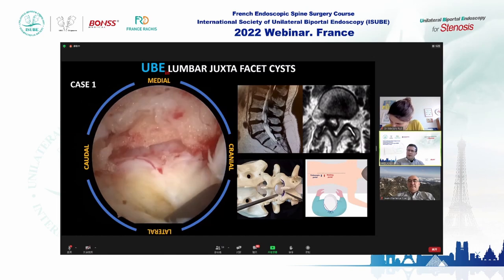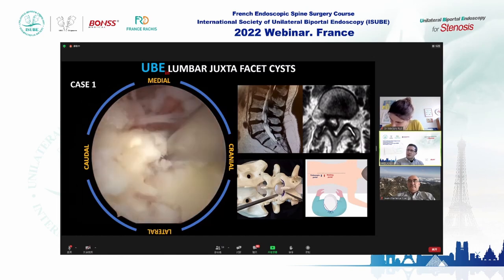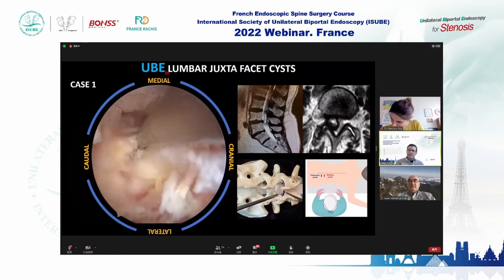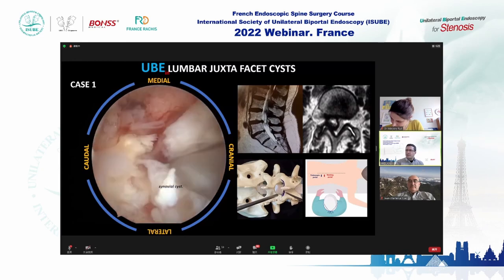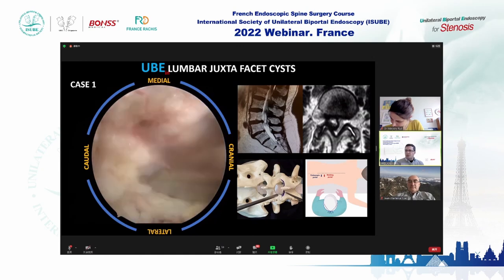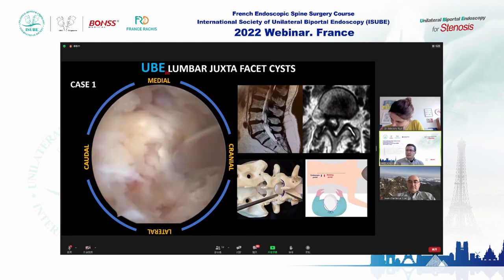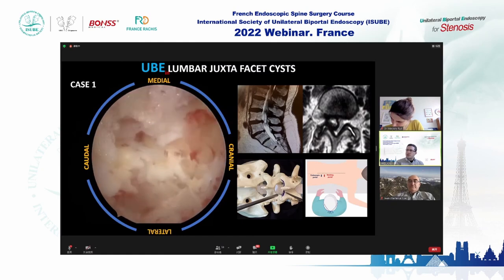This patient has a very degenerative spine, so we expected a very hypertrophic flavum ligament. I try to find the cyst and identify the epidural fat. I try to remove it and decompress the lateral recess. I am not feeling very comfortable — I am concerned about the dura. Look: this is the content of the cyst starting to float in the surgical view. We are now dissecting and trying to separate the cyst from the dura. They are strongly attached.